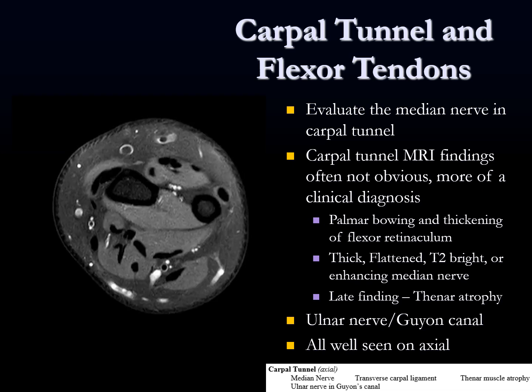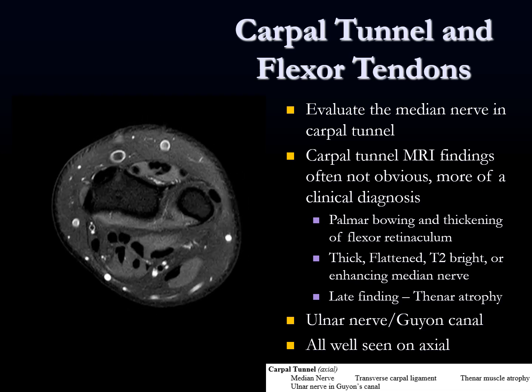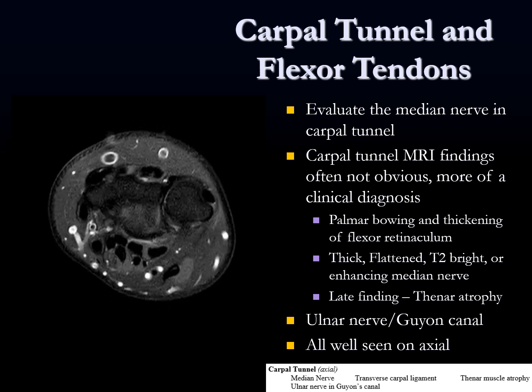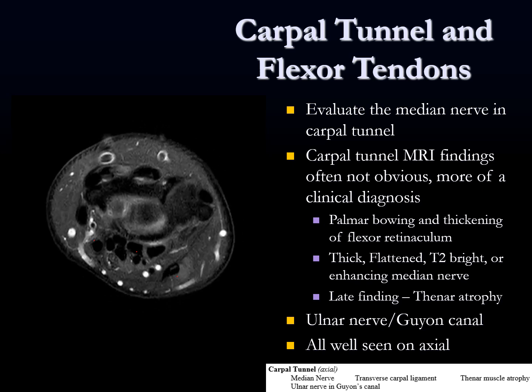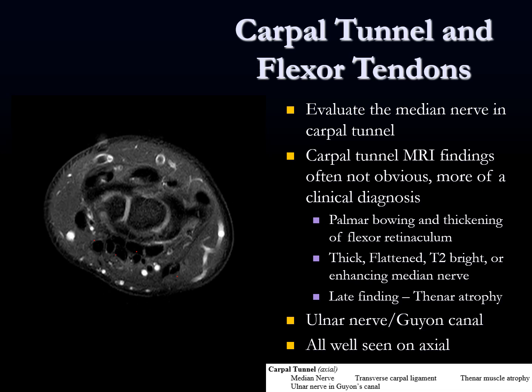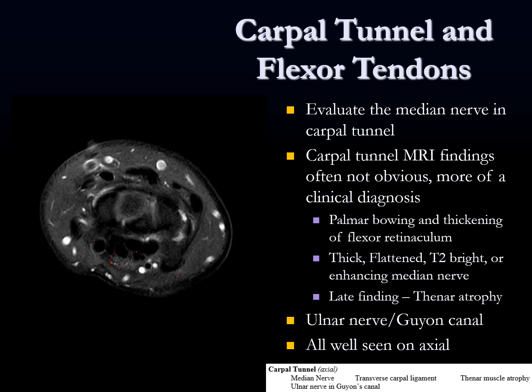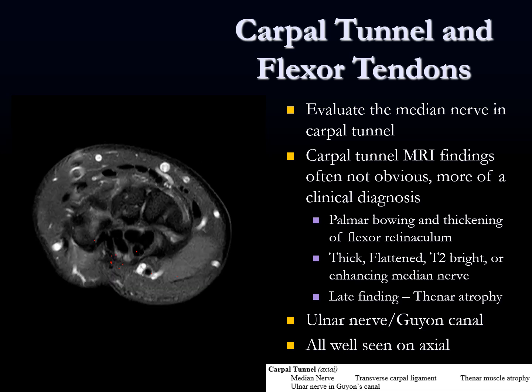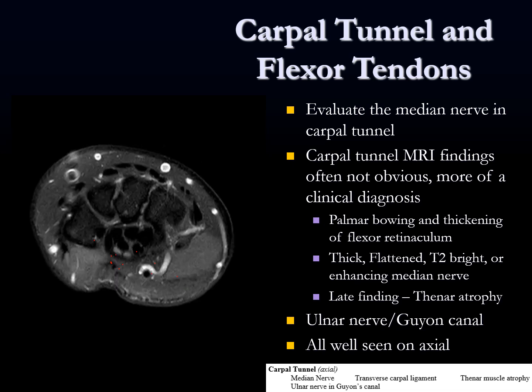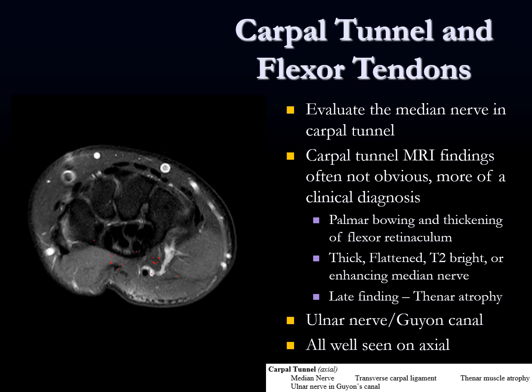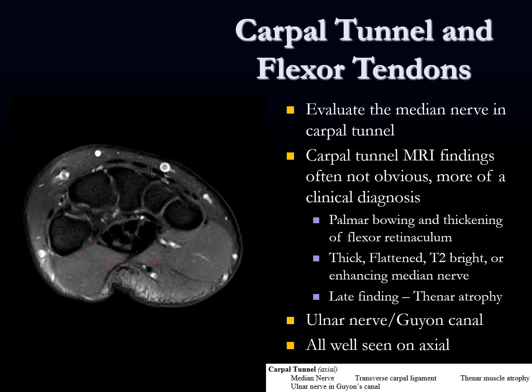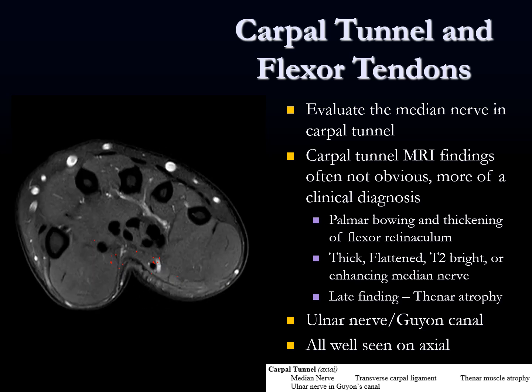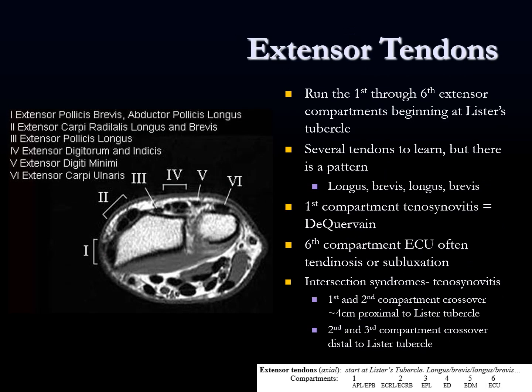Now we're going to be looking at the carpal tunnel and flexor tendons, reviewing the anatomy again: FCR, FCU, and the carpal tunnel. Here's the median nerve, which you can kind of make out on the fluid-sensitive sequences. And here's the ulnar neurovascular bundle — a little bit harder to see, but this is some of that ulnar nerve right there. That's a pretty normal look.